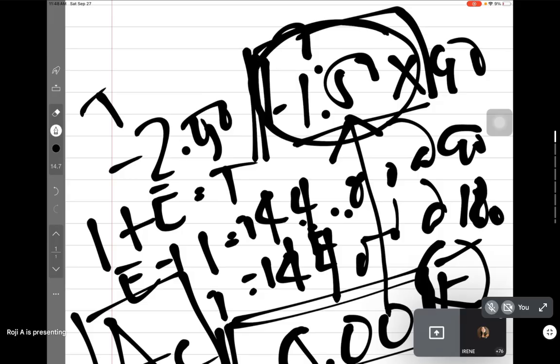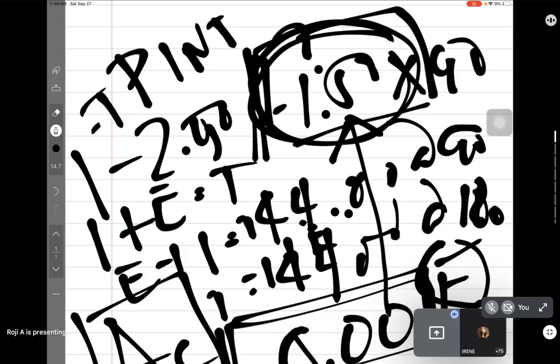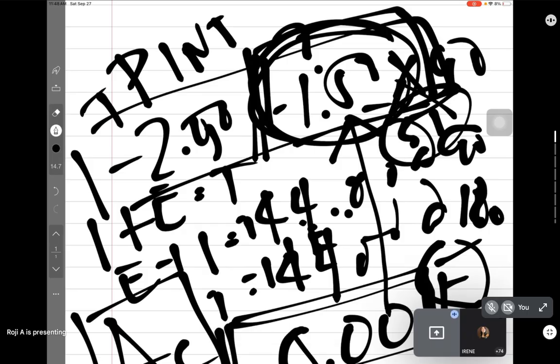From the internal. Very good. So this is purely internal. So your astigmatism in your manifest refraction is purely internal. And how do you address that? By giving soft toric contact lens, because soft toric contact lens is good for internal.